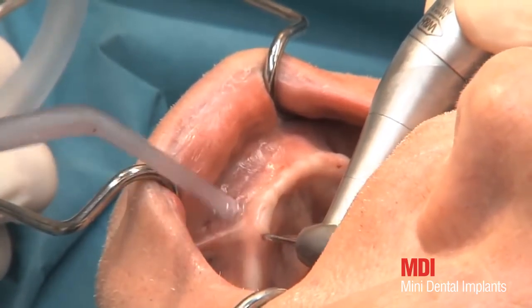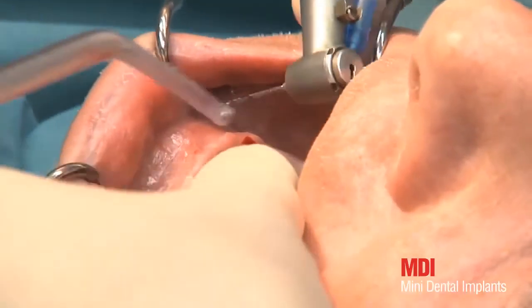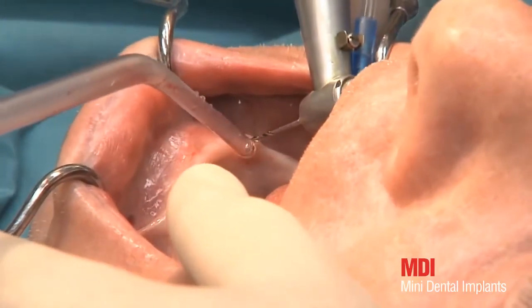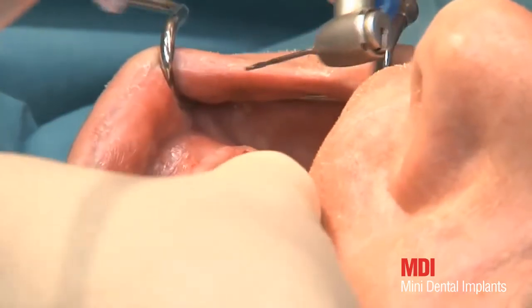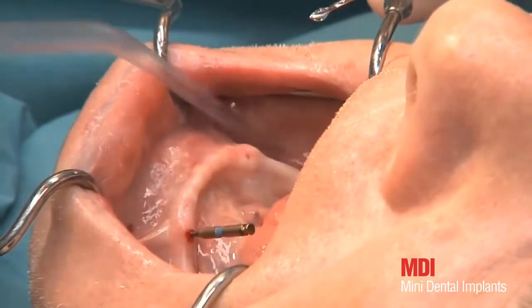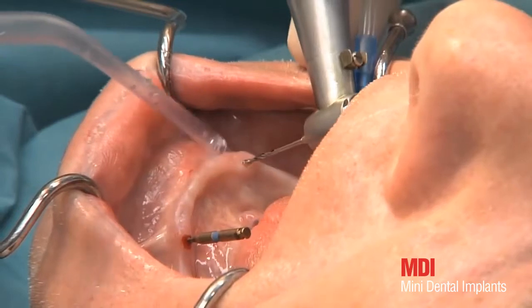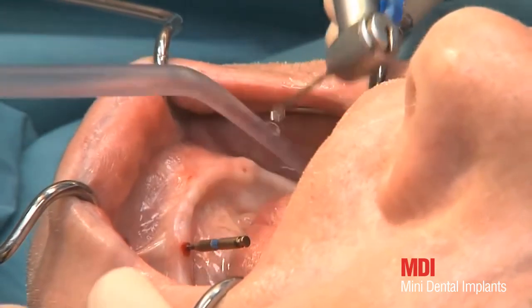The primary goal of pilot drilling is penetration of the cortical bone. Depending on bone quality, drill depths of between one and two-thirds of the length of the implant thread are necessary. The level of resistance decreases perceptibly on penetration of the cortical bone. Cut pilot drills can be used as parallelization posts.